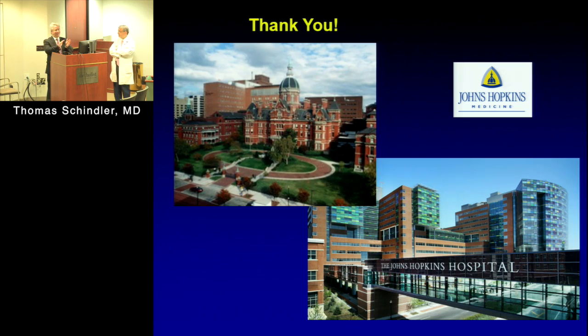And they show that, and then after 6 months or 4 weeks, in most cases, the edema has disappeared and the delayed enhancement went back to maybe 2 or 3 millimeter. And then you had subendocardial necrosis with an epicardial viable rim of 80%. So I think in the acute setting, I'm 100% in favor of PET. In the chronic setting, I'm a big fan of MRI, no doubt.